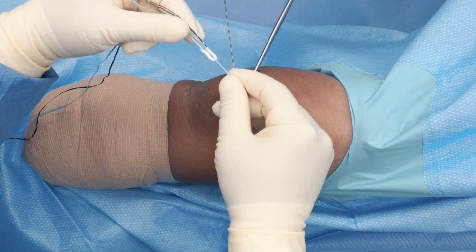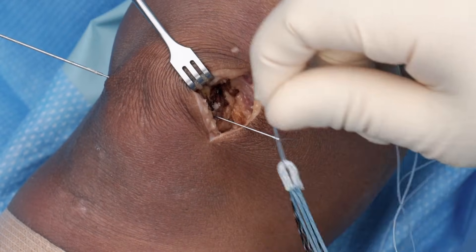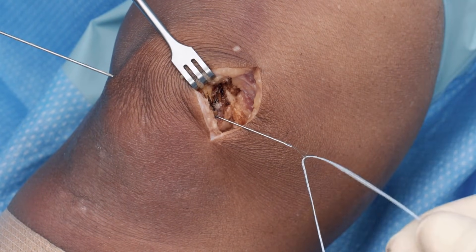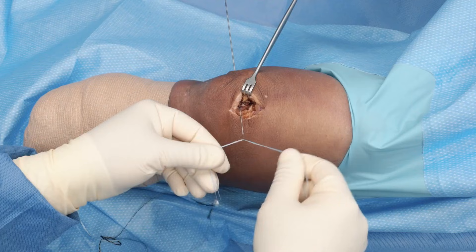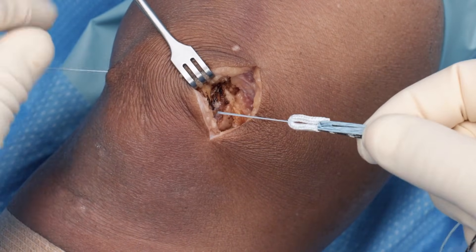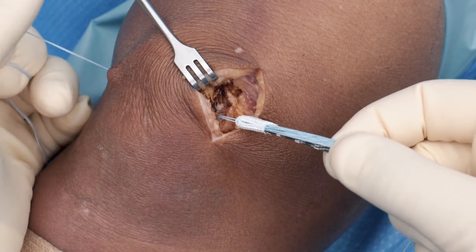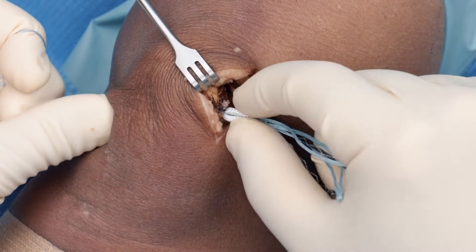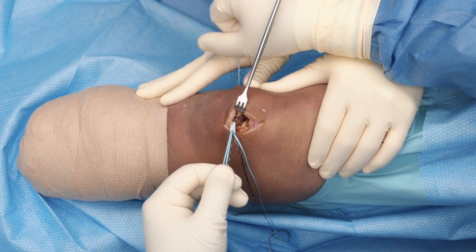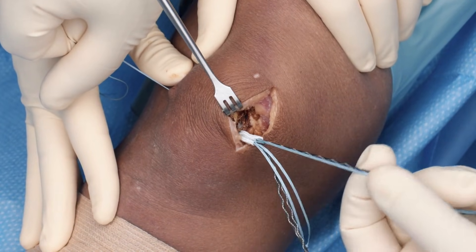The anchor is loaded with the O fiber wire suture at the apex. This anchor is going to be pulled in to the socket that I created using the passage of this K-wire. I've passed the tails through the nitinol loop, and I'm going to use the K-wire to pass the tails of the O fiber wire suture. Now I have the O fiber wire suture through the lateral side of the patella — just through the skin, there was no incision made on the lateral side. The anchor is hubbed up against the aperture of the 2.6 millimeter socket. As I'm about to pull in the anchor, to help give some counter traction, make sure you're lined up. You can pull back on the anchor, but you want to make sure you're pulling on the loops and not the sutures that would cinch down the loops.